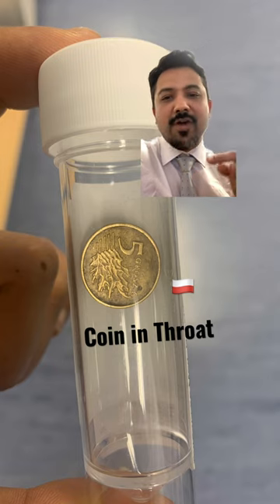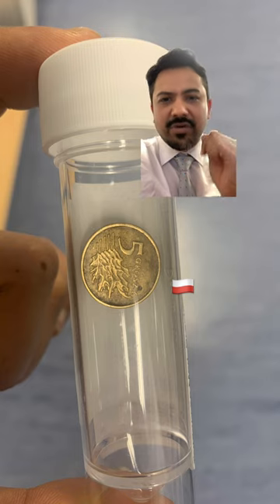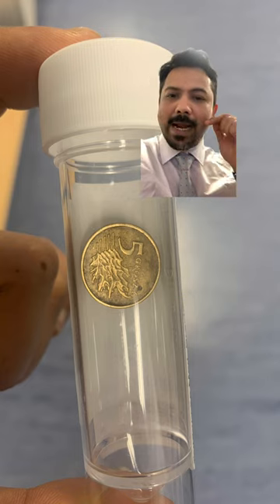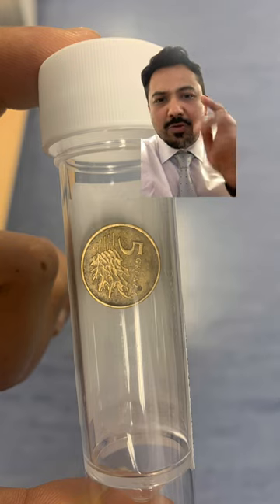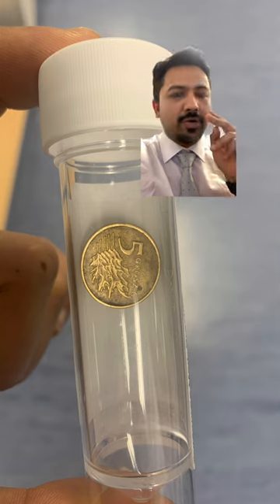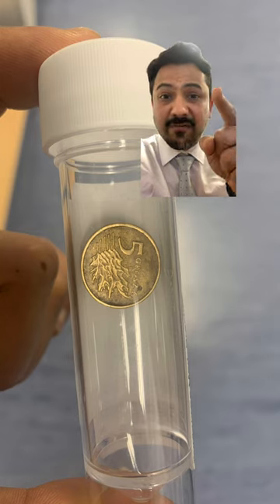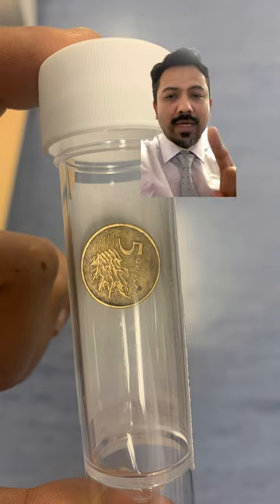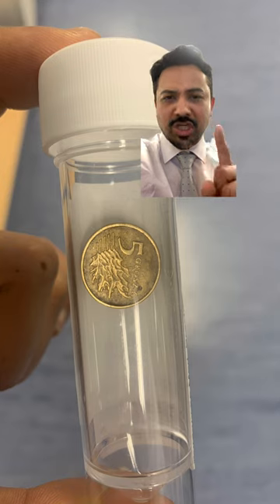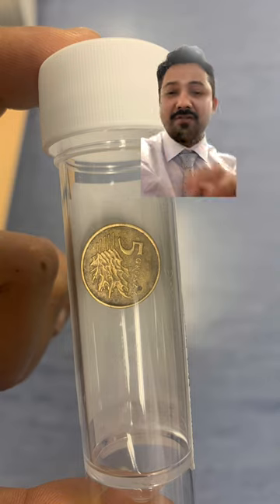So this coin was retrieved from the esophagus. The procedure was simple. We did a rigid esophagoscopy, and on direct vision, after seeing it, using the forceps we gradually took it out. You should understand and remember it should be done under direct vision — while taking out, the scope also comes out with it. One more thing: once it is done, a check esophagoscopy is necessary just to see if everything is normal.